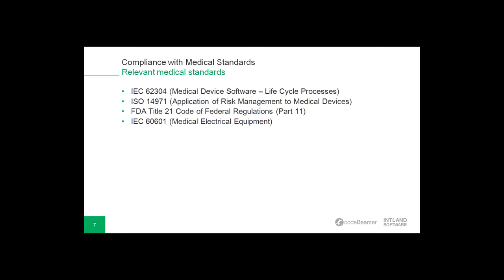So here is a list of various different standards, and I would like to start with the IEC 62304, which is an international standard which is applied both in the European Union and also in the United States. It specifies the requirements of software lifecycle processes in the development of medical software and the software embedded also in medical devices. It's widely regarded as the most important standard in this field and in the industry.